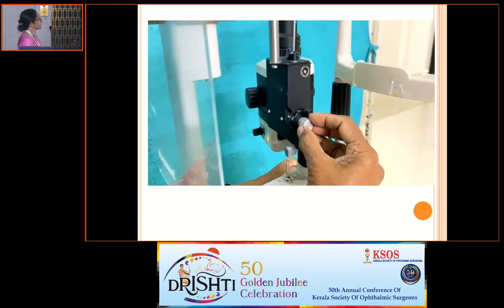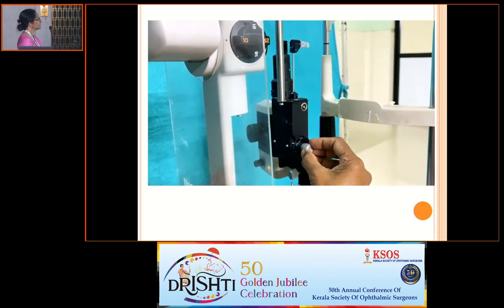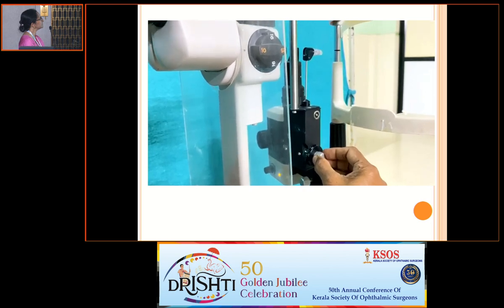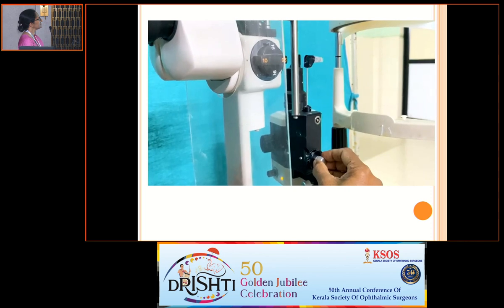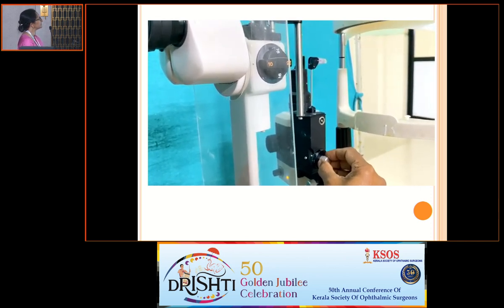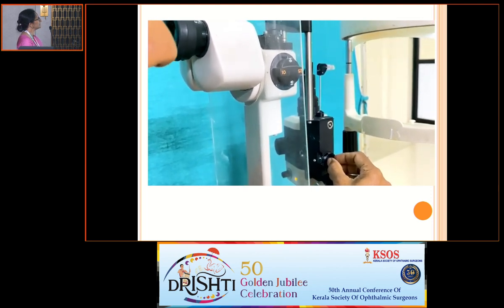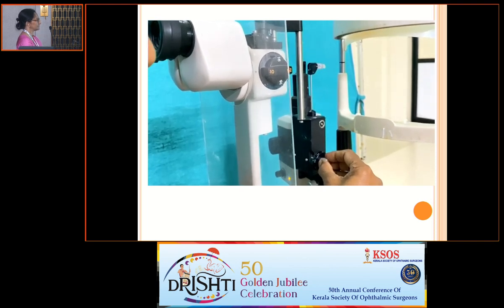Now turn the knob a little forwards, that is about 0.5 millimeters of mercury forwards, and we can see a forward movement of the feeler arm with the tonometer head. And now if we turn the knob backwards a little, that is about 0.5 millimeters of mercury, we can see a backward movement of the feeler arm and the tonometer head.